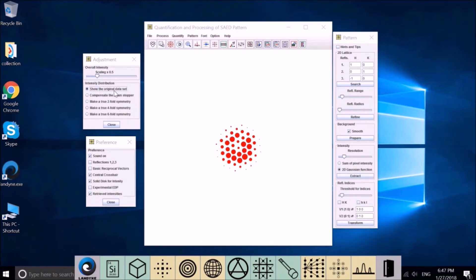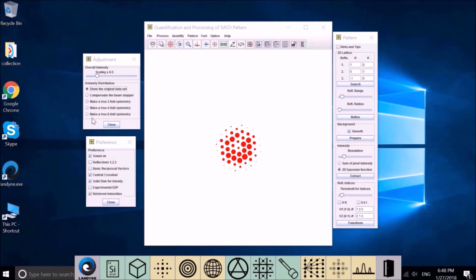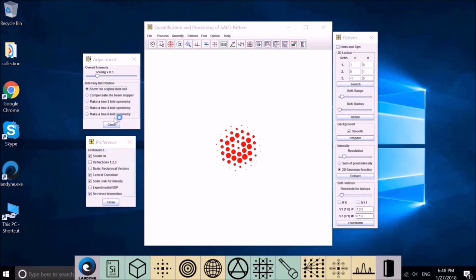Let's go back to intensity adjustment. There are several choices here for you to do in different situations. First one is as it is, you retrieve intensity. The second one is for you to restore the lost diffraction if you use a beam stop here. And the rest three deal with different symmetry.